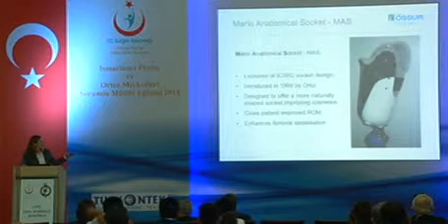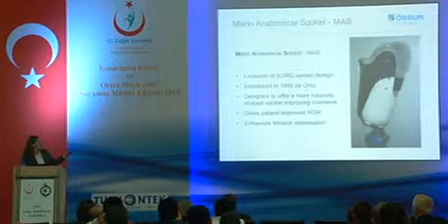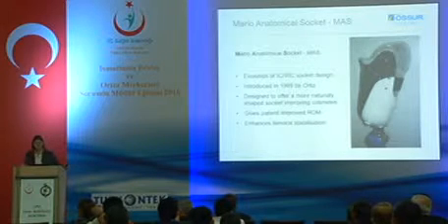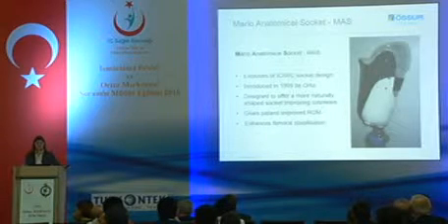He lowered the trim lines quite substantially, both anteriorly and posteriorly, because the bony lock now happened between the trochanter and the ramus.